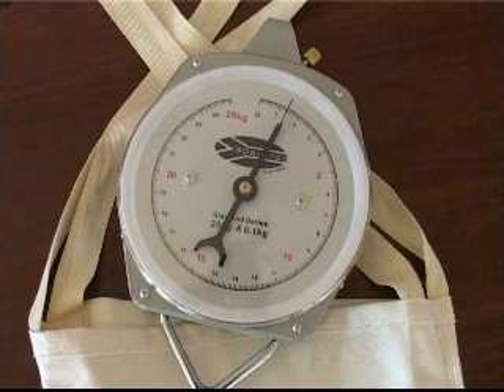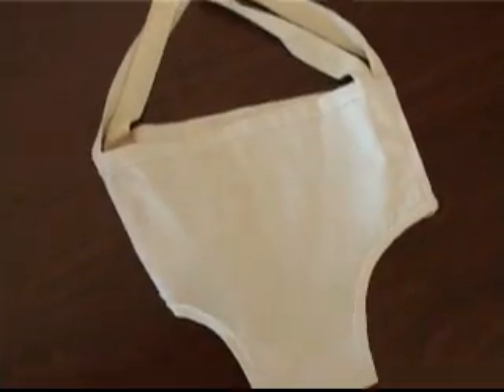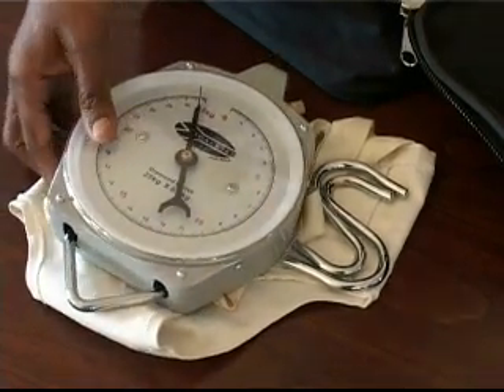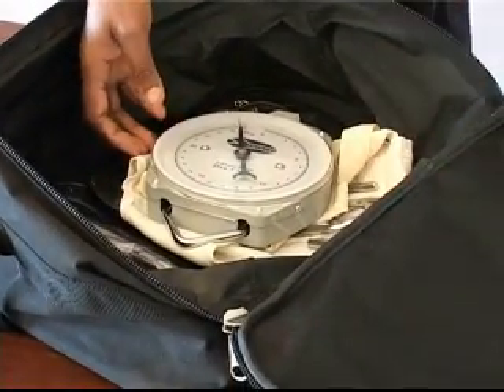The hanging infant scale, also named a portable spring balance, dial scale or salter scale, has a maximum weight of 25 kg, with markings at 500 g with 100 g graduations. These scales come with trousers and slings. Some models go up to 50 kg. Hanging scales are compact, small, easy to transport and read, and can be used for children up to the age of 5. However, they are not very accurate.